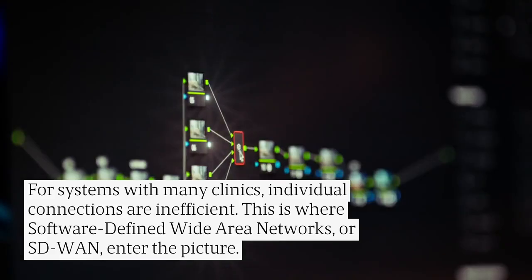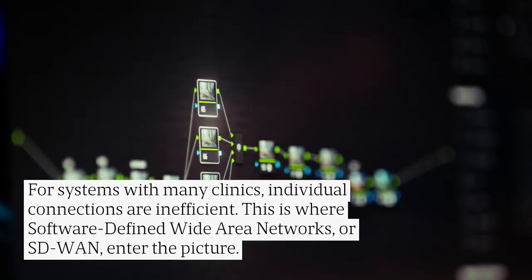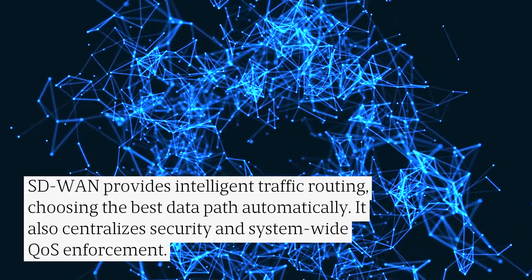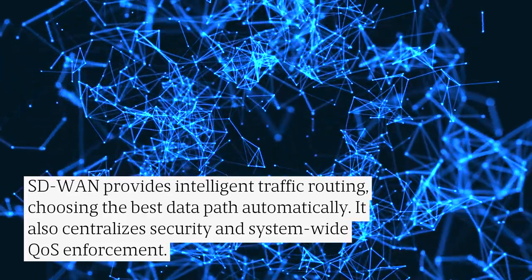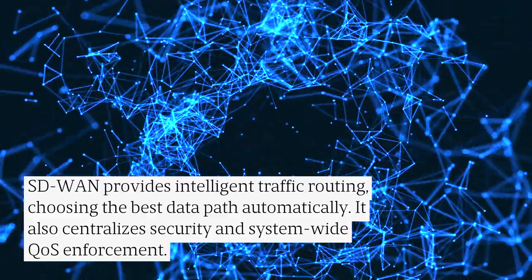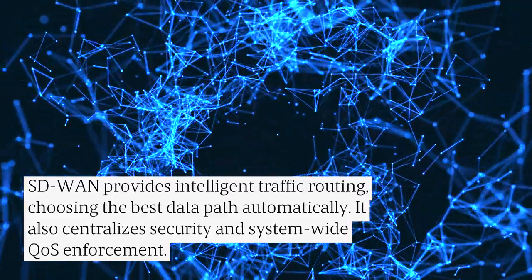For systems with many clinics, individual connections are inefficient. This is where software-defined wide area networks, or SDWAN, enter the picture. SDWAN provides intelligent traffic routing, choosing the best data path automatically. It also centralizes security and system-wide QoS enforcement.